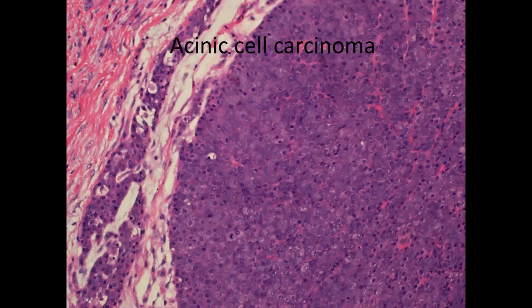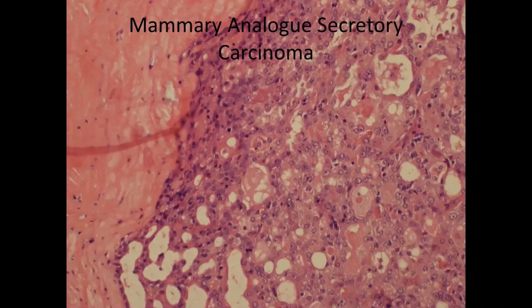Another tumor that may fall under this heading, something that I think has not been described all that well in cytology, is mammary analog secretory carcinoma. These are tumors that in the past had been called hypogranular acinic cell carcinomas. So again, they look like acinic cells, but just without that coarse basophilic granularity. These have been recognized to have a characteristic ETV6 and NTRK rearrangement, similar to secretory carcinoma of the breast and various pediatric fibrosarcomas as well as kidney tumors.